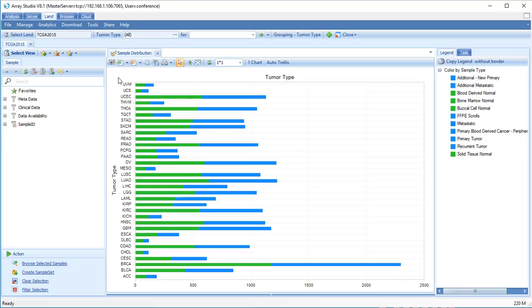Let's search for a gene in TCGA land to explore gene-level data and views. In the search box, type NUSAP1.